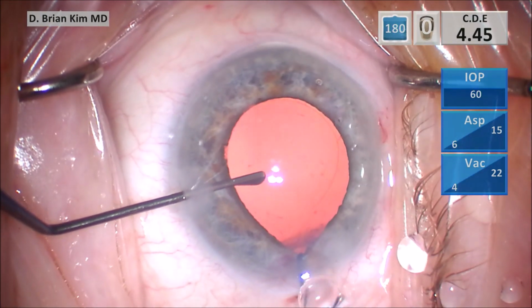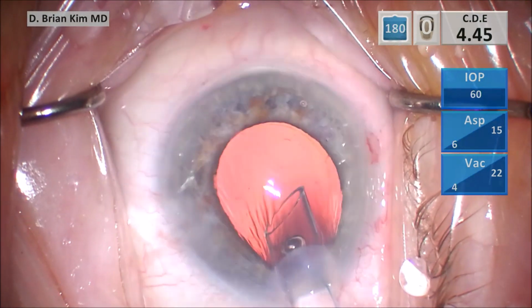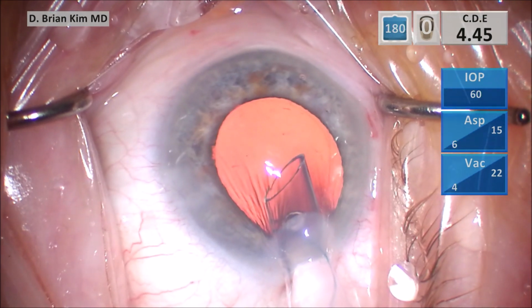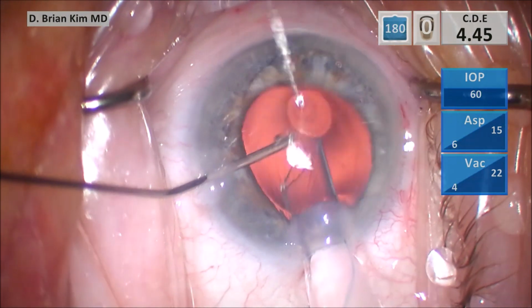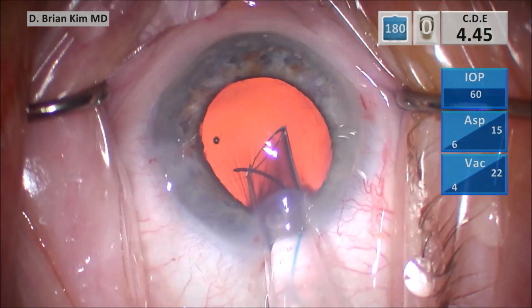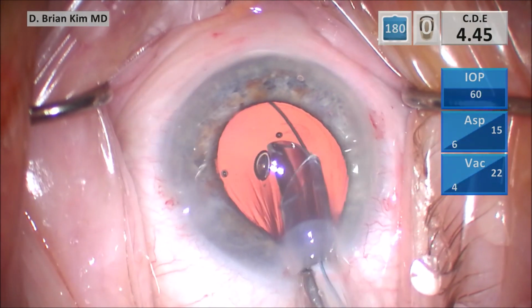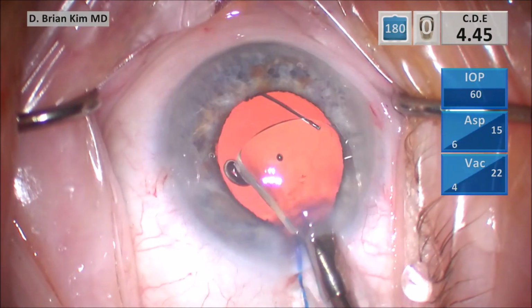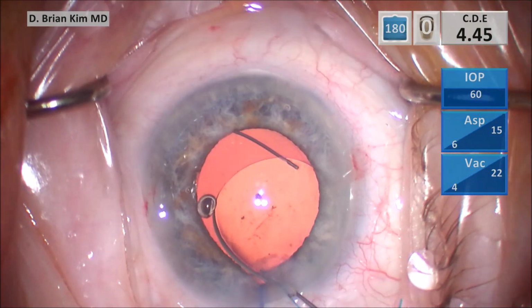So I widen the incision with the blade because this is a 3-piece lens. I place it in, and because I had to push when I went in, I'm going to go ahead and push some more cohesive viscoelastic to fill the bag. Go ahead and deliver the leading haptic into the bag. Again, I do this with the bevel facing to the left. The optic comes out. I rotate counterclockwise 90 degrees. Optic comes out correctly. And then I'm going to use a Maltzman to dial in the trailing haptic.